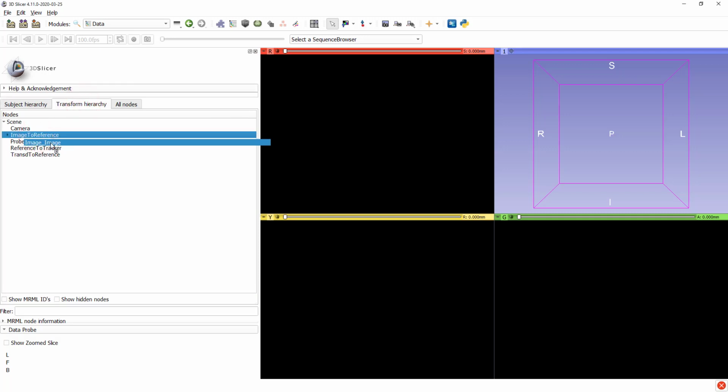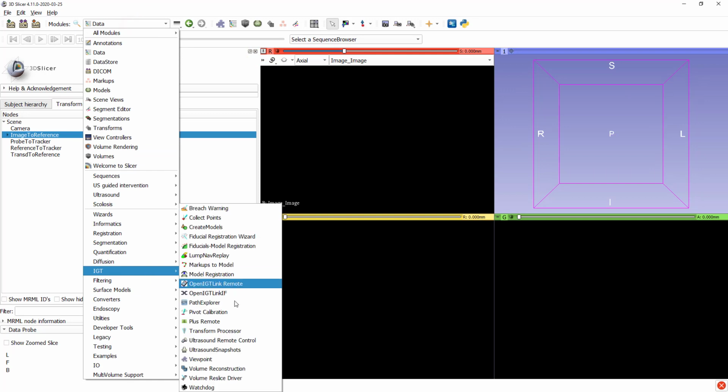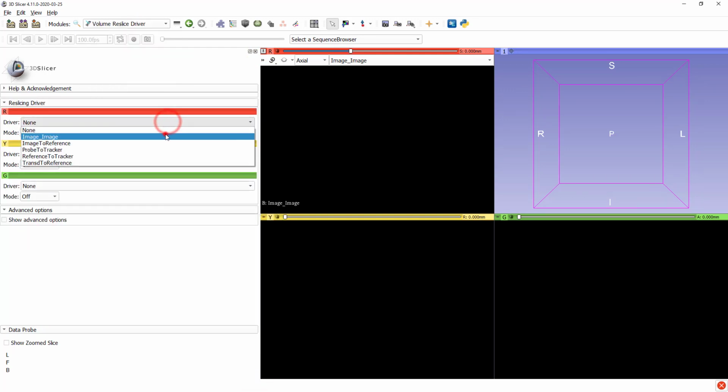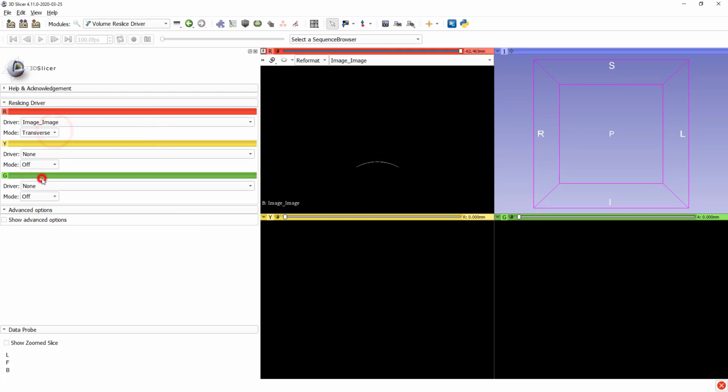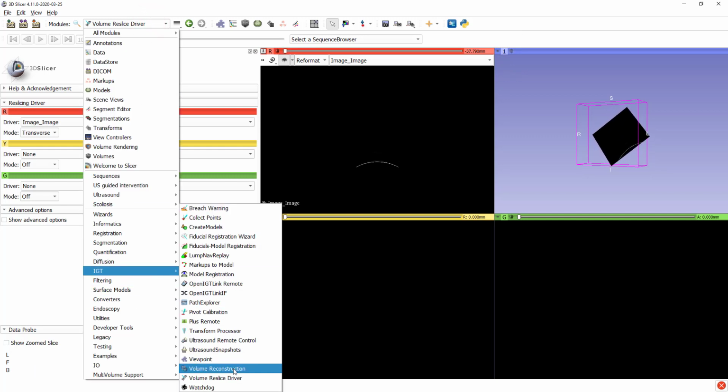We have a simple tracked ultrasound image. We just need to place the image node on the image to reference transformation node. We will visualize the image in the red 2D viewer, and we use volume reslice driver to keep the view in the ultrasound image and follow the image. We visualize the image in the 3D viewer as well and check by moving the ultrasound that both the image and the transformation is transmitted to Slicer.